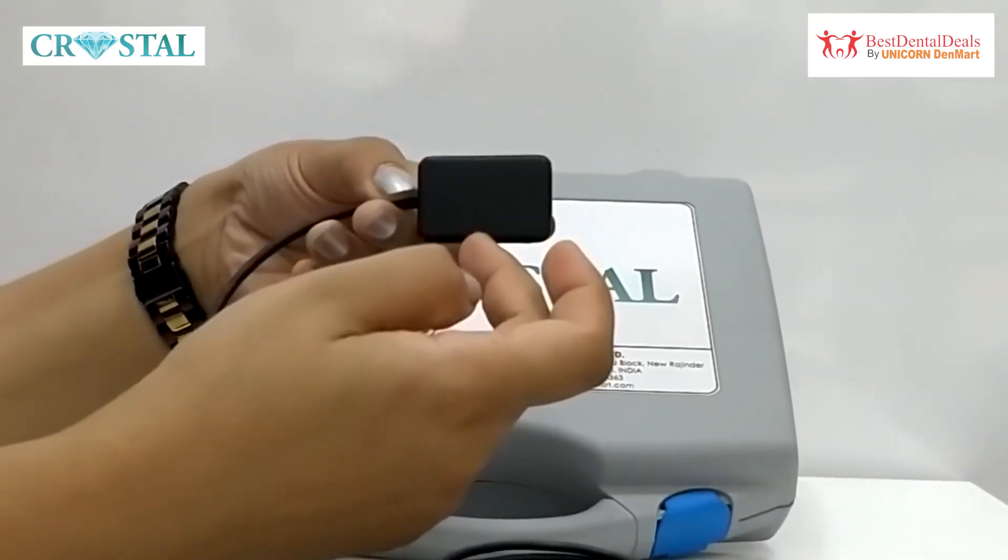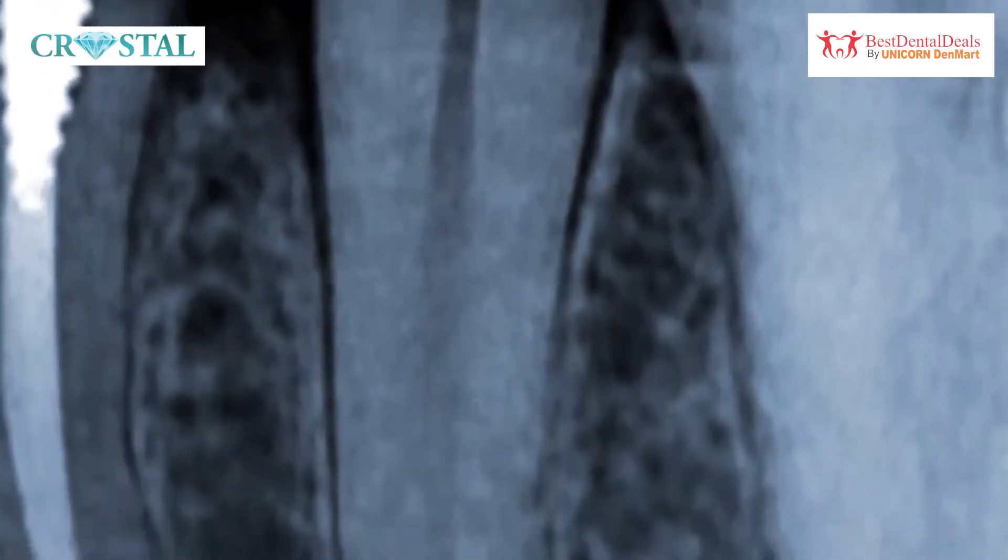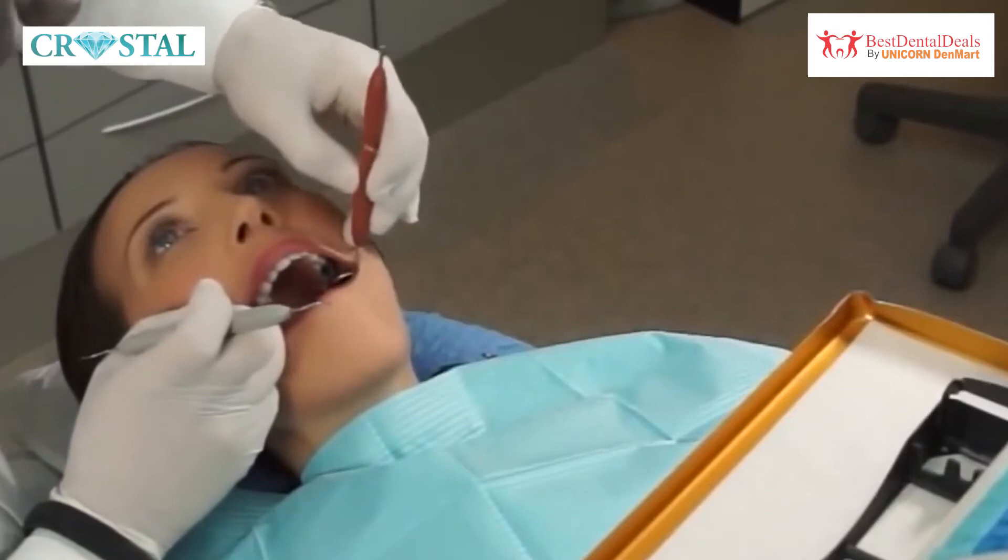It is available in standard size 1, which covers up to 3–4 teeth for imaging, making it suitable for both minors and adults.